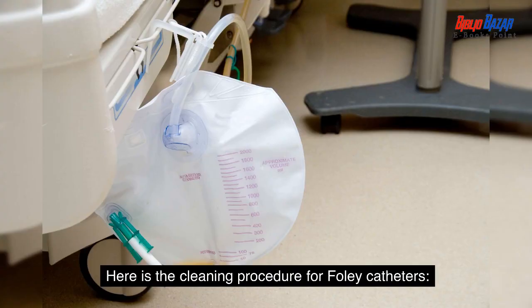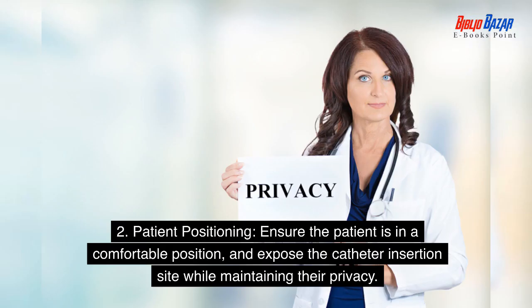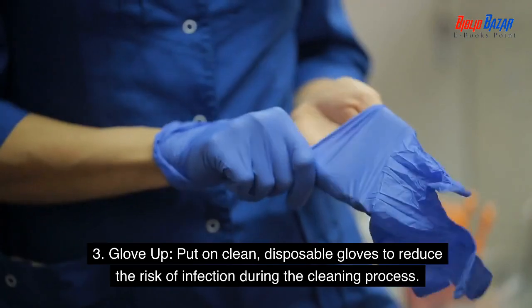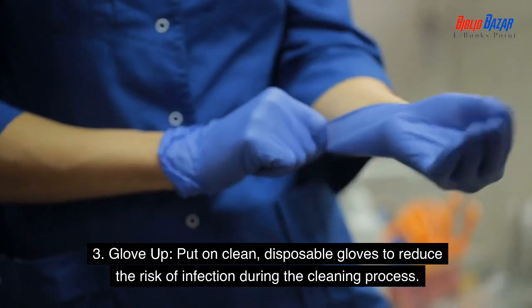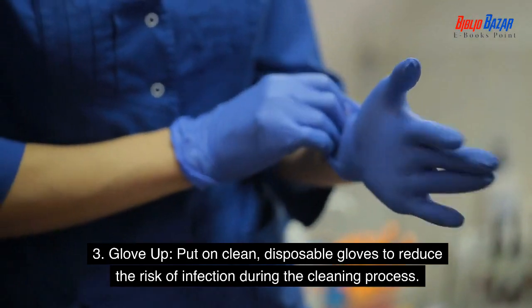Here is the cleaning procedure for Foley catheters. 1. Gather supplies. Prepare all necessary supplies, including clean gloves, mild soap, clean water, clean towel, and a catheter care solution as recommended by the healthcare facility. 2. Patient positioning. Ensure the patient is in a comfortable position, and expose the catheter insertion site while maintaining their privacy. 3. Glove up. Put on clean, disposable gloves to reduce the risk of infection during the cleaning process.